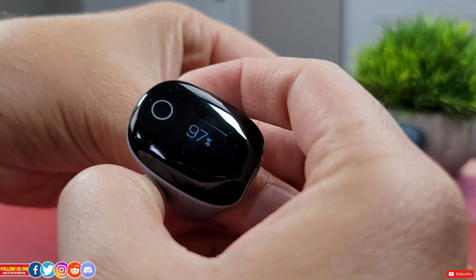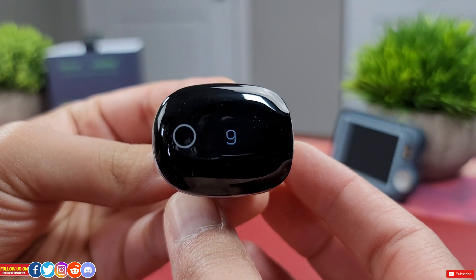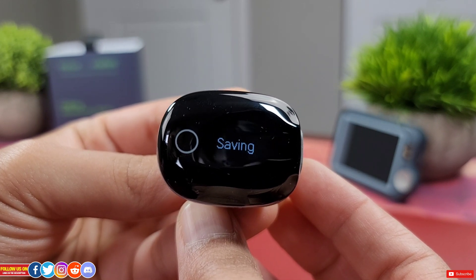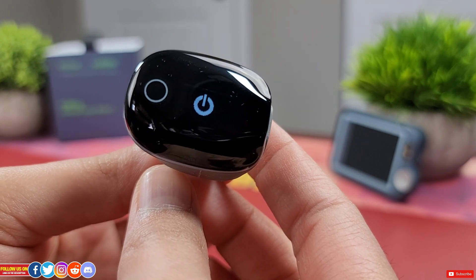As soon as you take it off after wearing it for a few minutes, a 10-second countdown timer will start, and at the very end the reading will be stored. This O2 ring can store 4 readings, after which a new reading will override the first one.